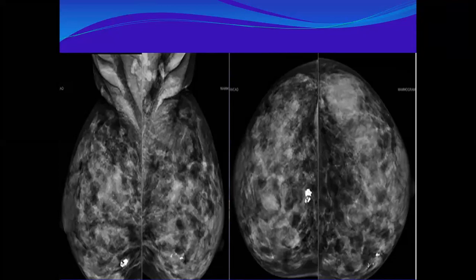Continue, Hannah. Yes, it is not well appreciated on the mediolateral view. Nothing in the left breast. Let me guide you. Anything in the left breast? On the left breast, on the outer side, there is a focal asymmetry. Large. Okay. Yes, excellent. There is an area of asymmetry seen on the outer CC view. Could you appreciate it in the MLO? No. Okay, what is next?